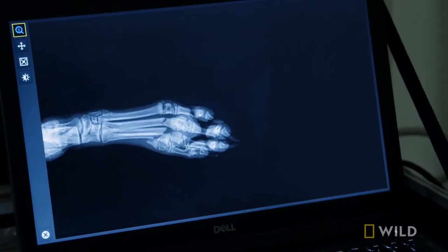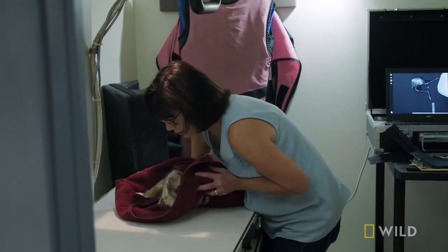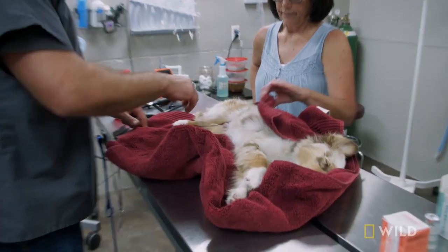In a lot of dogs, fractures like these need surgery. But because Knox is a puppy, I don't think that's necessary here. Instead, we can just stabilize that hind leg so it can heal on its own. But before we can do that, I need to reset the bones so they can heal back in place.